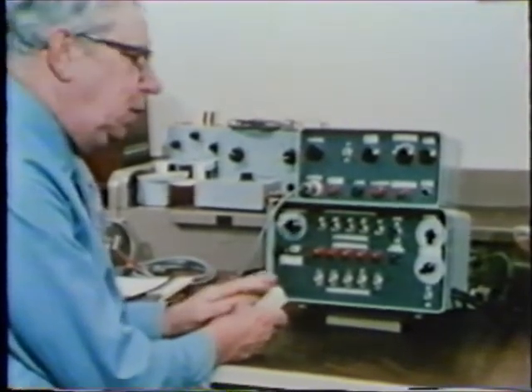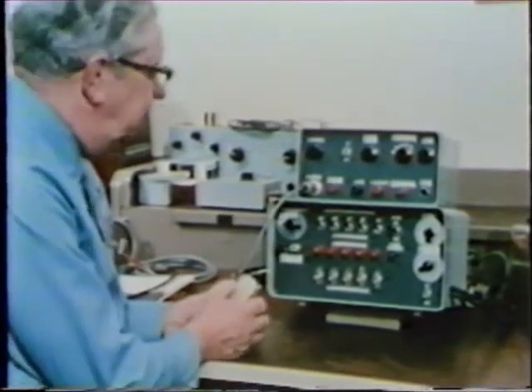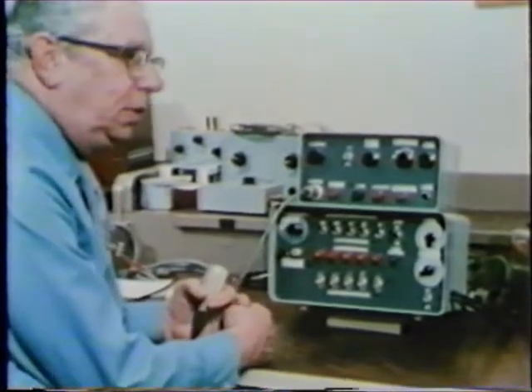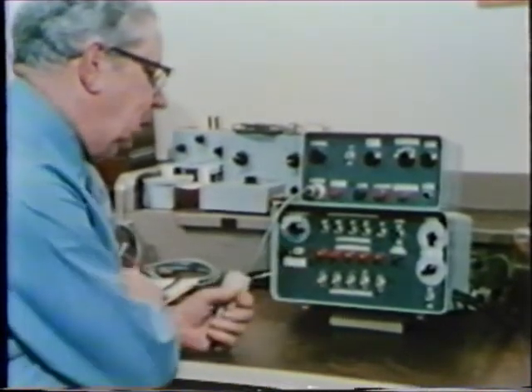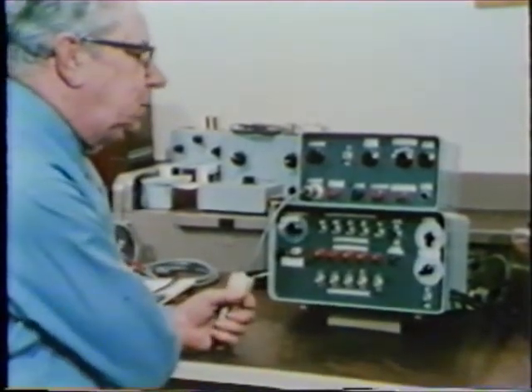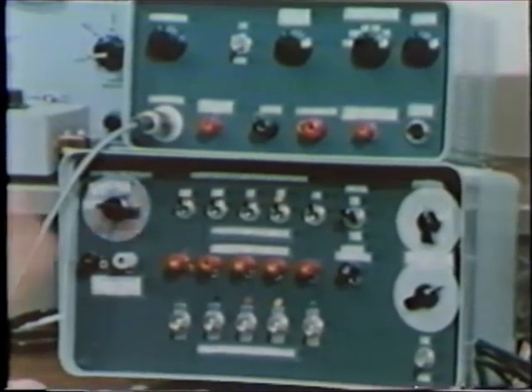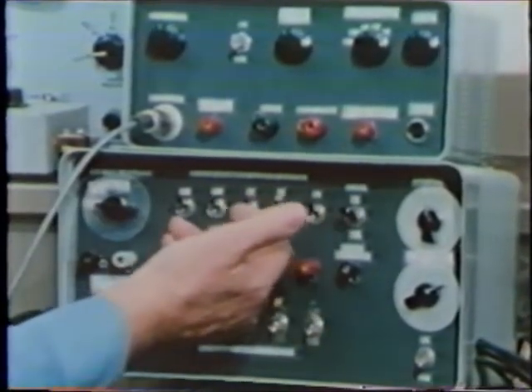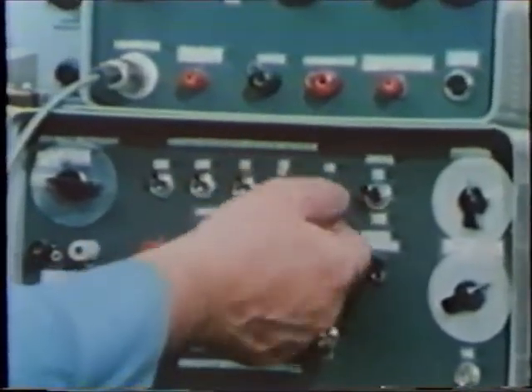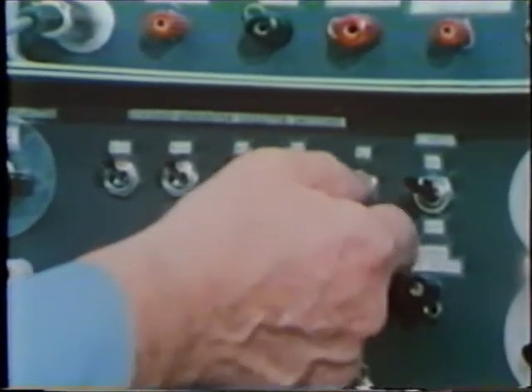If Charles Grazer was to hear speech, he would have to respond to the range of speech audio vibrations. The range of speech sound vibrations is 500 cycles to 3,000 cycles. We built this device to convert sound into corresponding electronic signals and then superimpose them on a carrier wave. We could also reduce the frequencies, or electronically speaking, we could count them down.